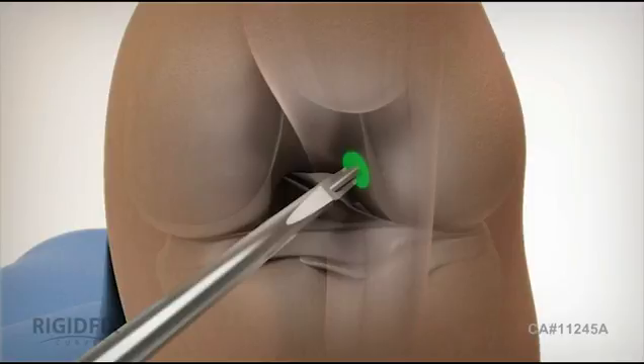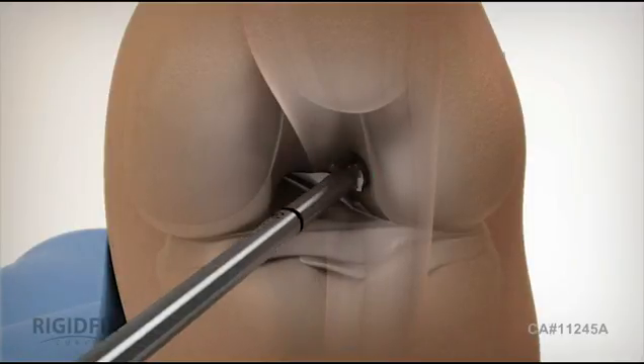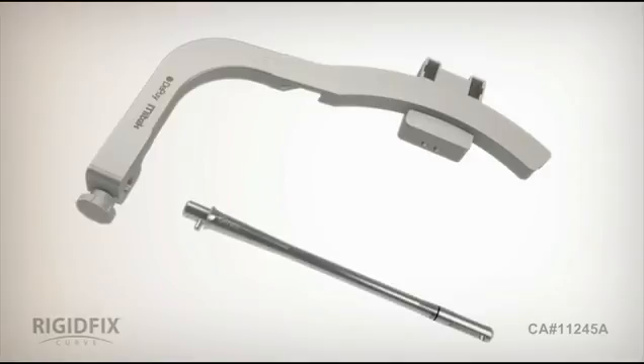Select the reamer size to match the graft diameter and ream the femoral tunnel to a depth of 30 millimeters. Select the femoral rod size to match the femoral tunnel diameter and attach it to the rigid fix curved frame. Here, the left knee configuration is shown.